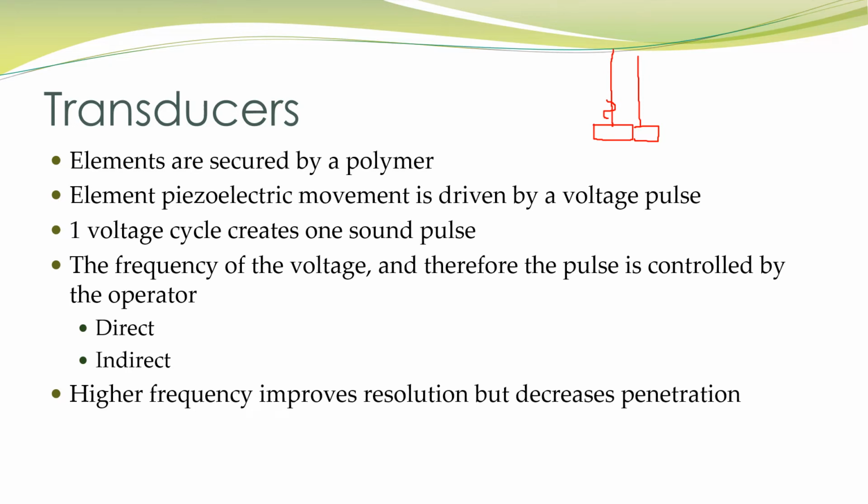Now, when we say cycle, we're really looking at one complete positive and negative cycle of the electrical charge. When we have one complete cycle of voltage, it will produce what we call one pulse of sound. The pulses of sound that we use in diagnostic imaging are usually 2 to 3 cycles in length. So one voltage produces one pulse of sound. And like I mentioned on the last slide, that pulse of sound would be followed by listening time, allowing time for that sound to interact within the body, come back and deliver signal to the piezoelectric element.